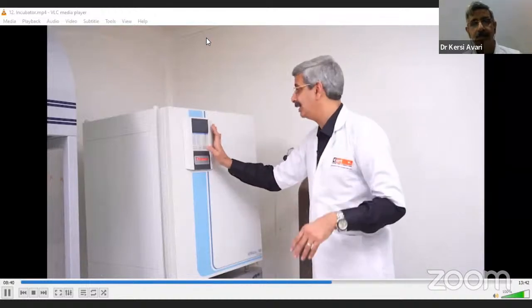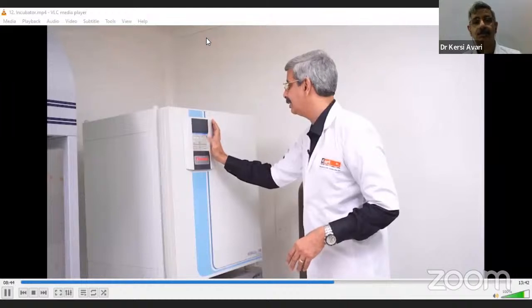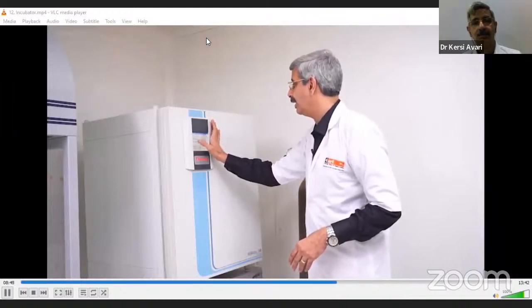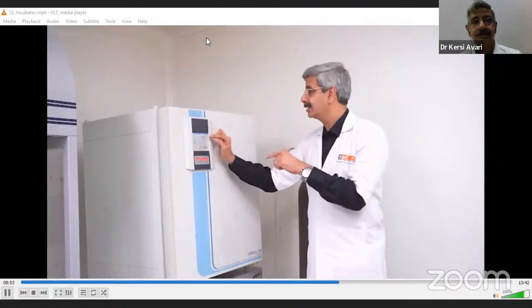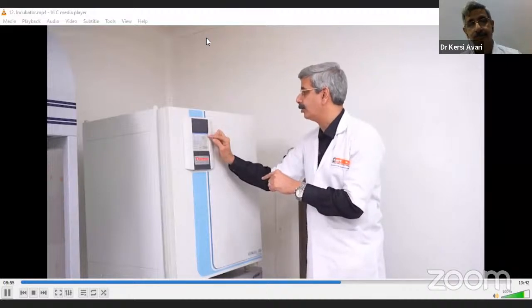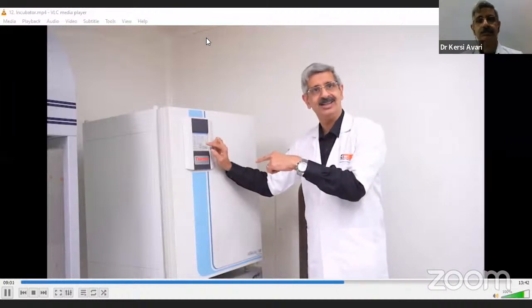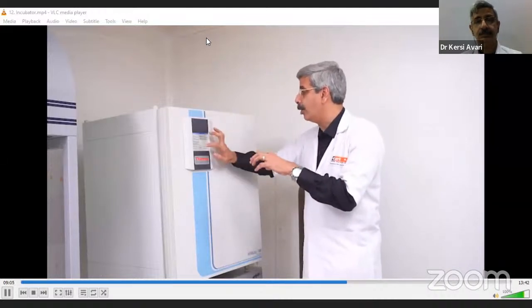So you can track. Now the error table. Yeah, see what all happens? Sensor breakdown, actual flow low error, no water, no water. So any problem is recorded over here, correct? But then all these things are logged in the door.